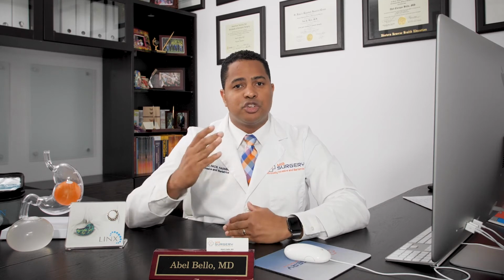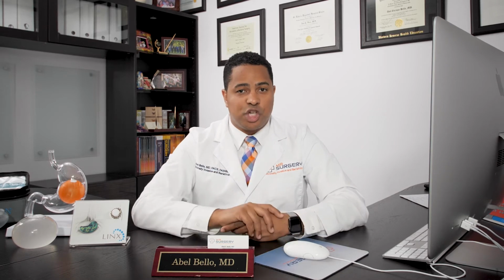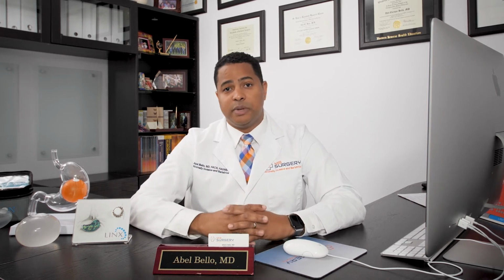That means you have a longer segment of Barrett's that is affected, or you have Barrett's that is changing, meaning it is developing dysplasia, progressing towards cancer. In those scenarios, we have to treat the Barrett's first. We treat the Barrett's by inserting a special camera into the esophagus, and we ablate or burn the areas that have changed. We place the patient on optimal anti-reflux medication while we surveil the Barrett's. There are instances in which we have to do repeated therapies to burn the Barrett's completely.